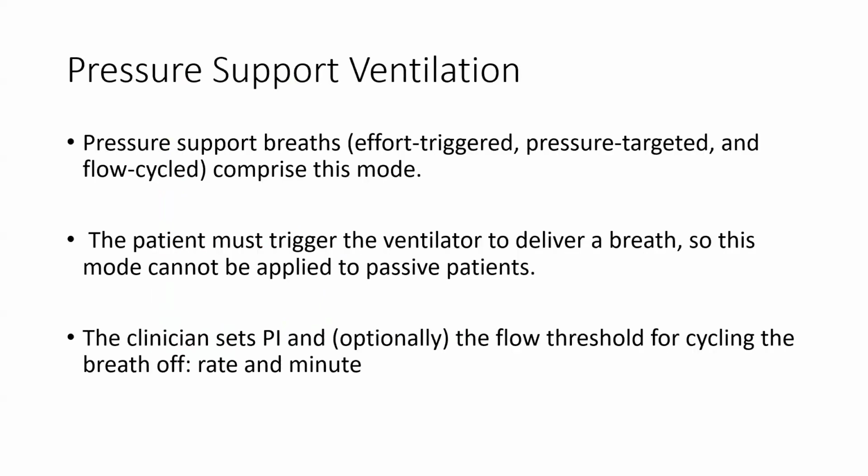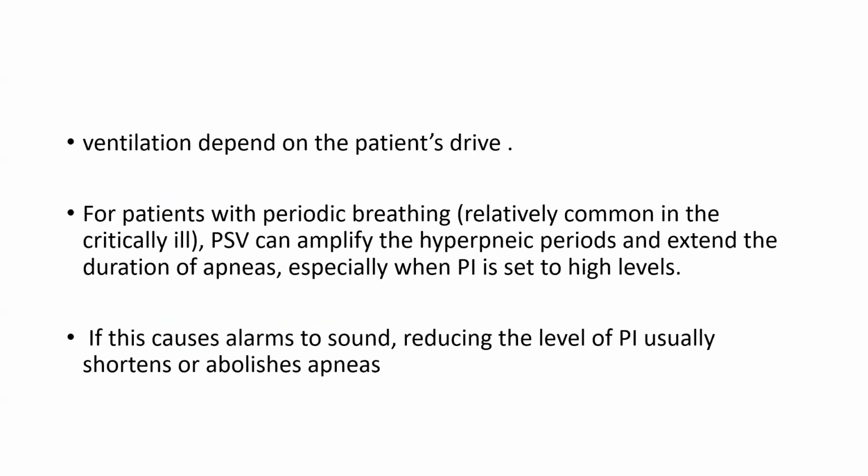Now the next mode is pressure support ventilation. Pressure support breaths are patient-triggered. The patient must trigger the ventilator to deliver the breath, so this mode cannot be applied to the passive patient. The clinician sets the inspiratory pressure and the flow threshold for cycling the breath off. The rate and the minute ventilation depend upon the patient drive.